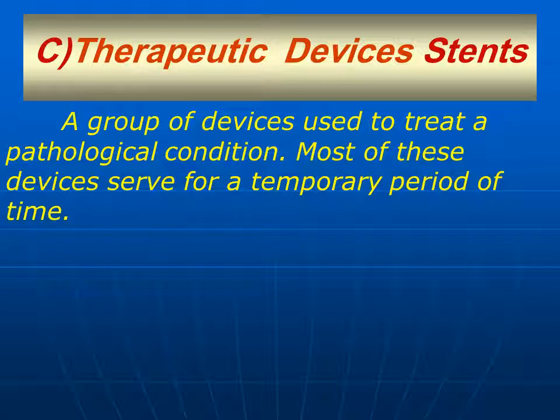The third group is called therapeutic device stents. This group of stents is used to treat pathological conditions. Therefore, it's used for treatment, and that's why we call it therapeutic device stents. Most of these devices serve for a temporary period of time.